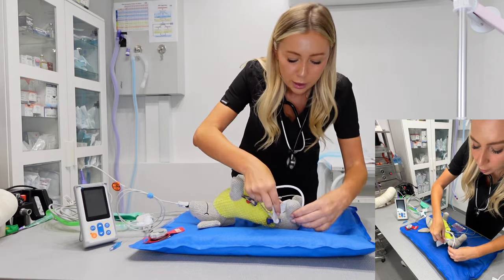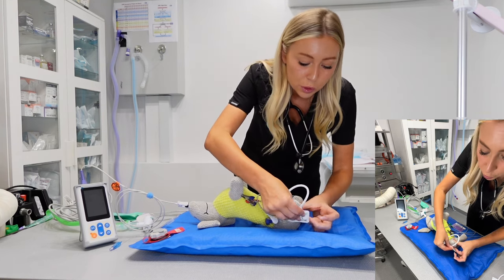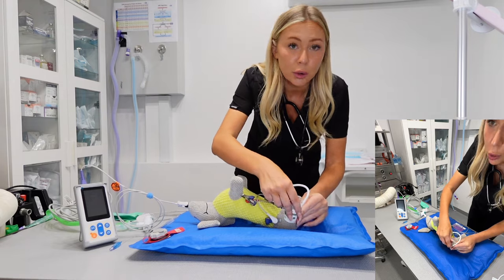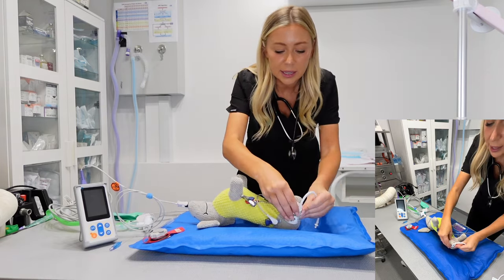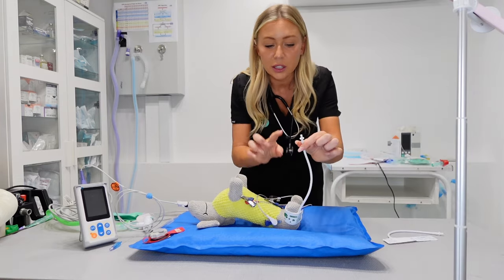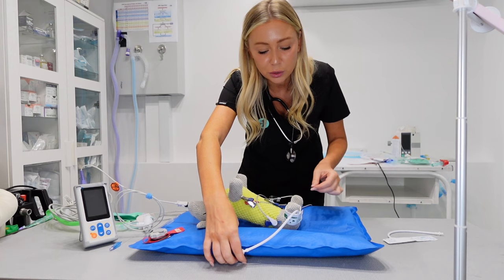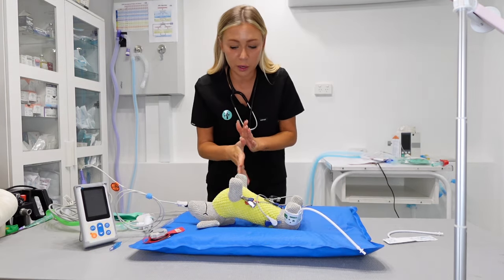I've done another video on how to measure up for blood pressure, so if you still need help with blood pressure cuffs, make sure you go and watch that video. So we're going to wrap around — that's nice and snug, not too tight and not too loose. I would then attach this to my blood pressure monitor and press start.